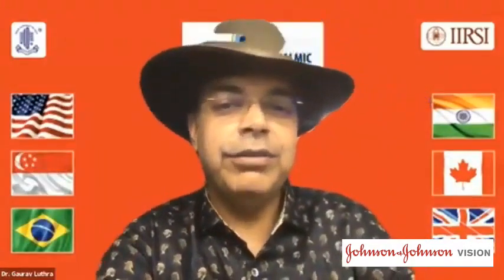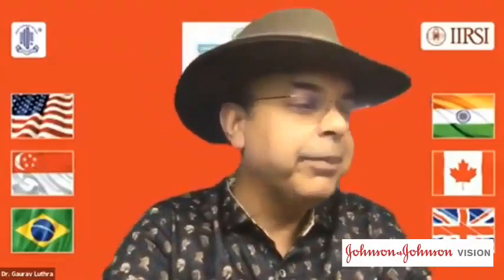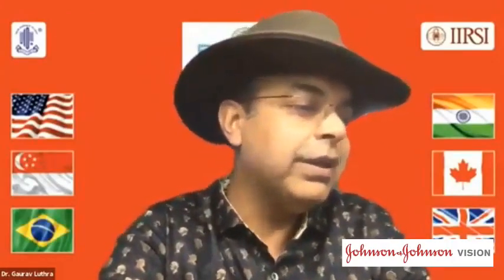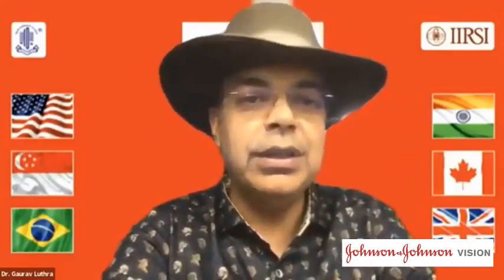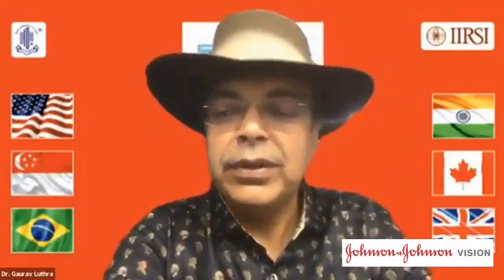I have a question, Namrata, and this one is from Dr. Bhushan. And I'll ask Ron Kruger if he's here, I can't see him. The question is, did you ever encounter iris cheese wiring while doing a single pass pupilloplasty? And which kind of iris should we avoid doing a single pass pupilloplasty? Is Ron here? Yeah.